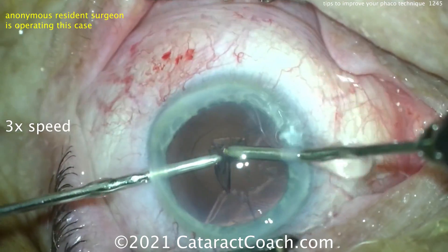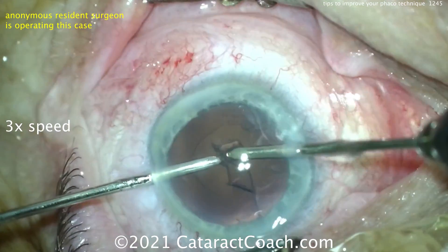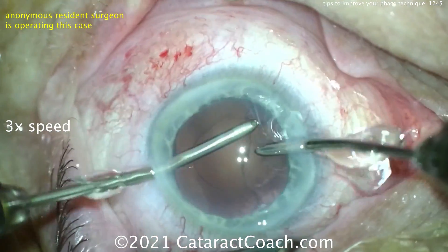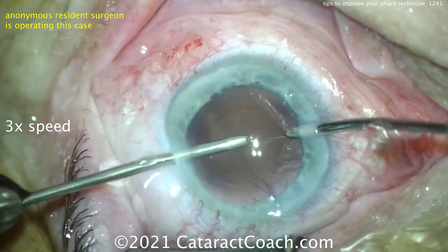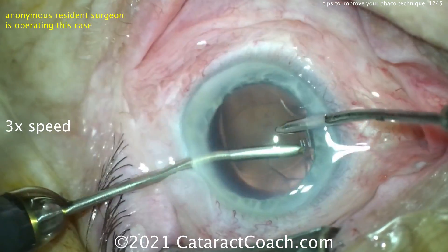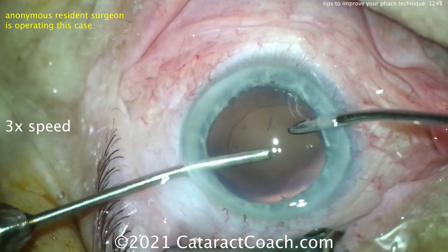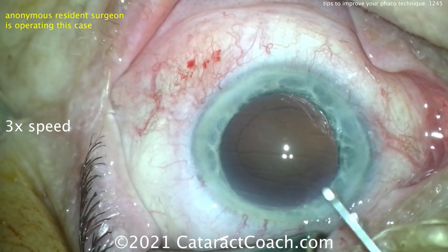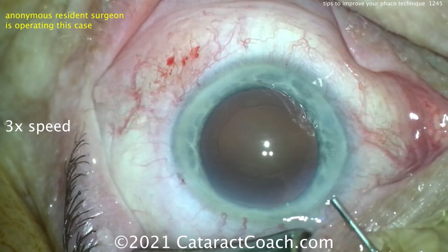Again: the draping, the speculum, the patient's head position, floating in the incisions, keeping the eye in primary — these are so much more important. Your goal right now is not speed — don't worry about speed; in fact, don't even worry about efficiency. Worry about precision: keep the eye in primary, keep the eye centered up, float in the incisions. Those are your important lessons at this stage of your learning.